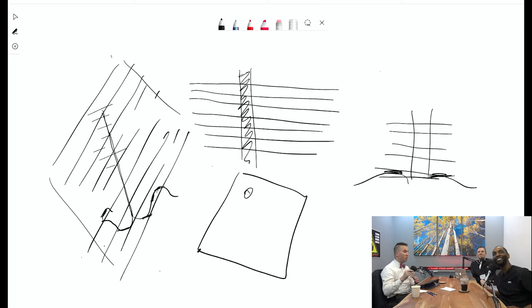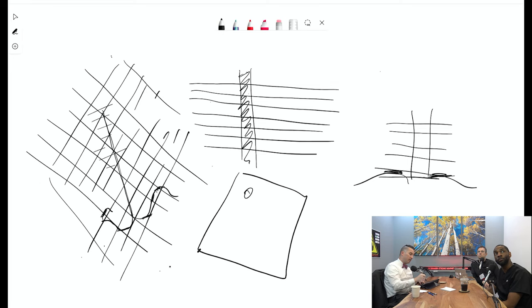To make it to where there is no complete saturation of a certain vessel that's running parallel to the slice, because there should be no vessel that could possibly run parallel to all three obliques. I see. Nice. Now, people can get around that a couple of ways. Sometimes people do a pre and a post. Oh. So the contrast will help limit the saturation as well. Mm-hmm. Or they could do two non-contrasts at 90 degree angles from themselves.